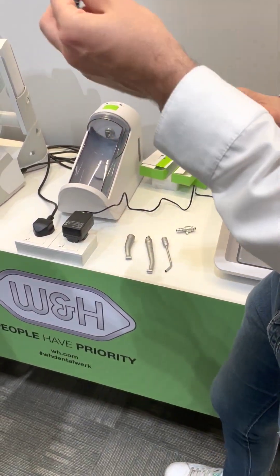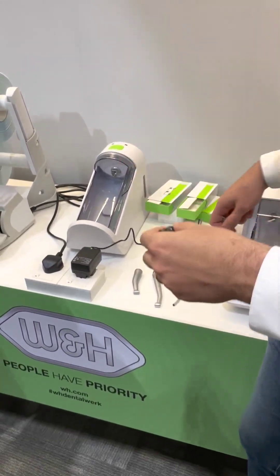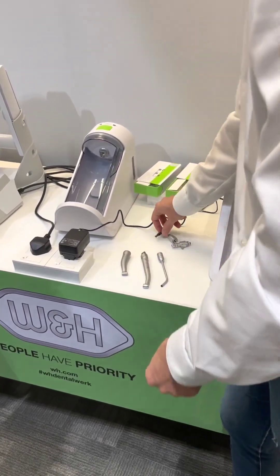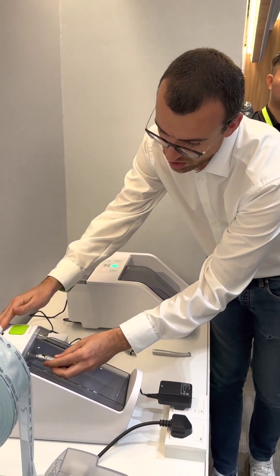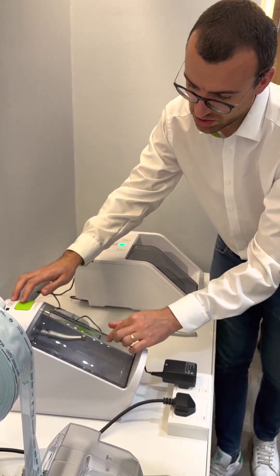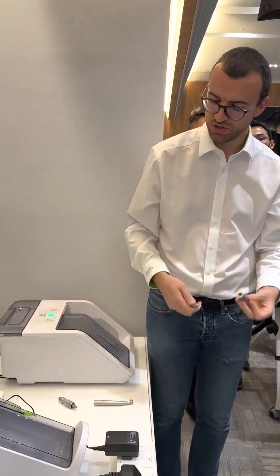For example, if they have cable, which is quite common, there is a specific adapter for cable, and it works on both devices. Place inside, close the door and press it, then remove and change the pieces.